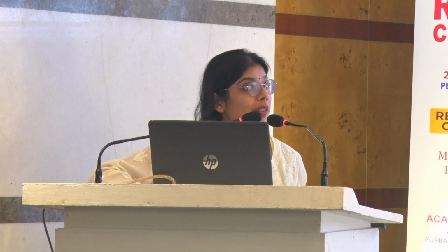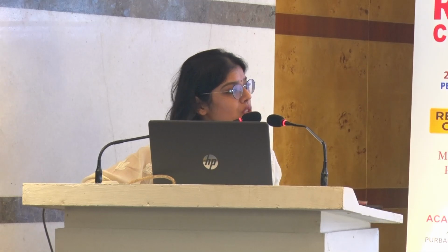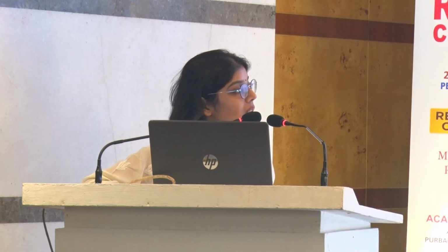So a few cases of heel pain. Heel pain can be because of multiple causes. This is a small retrocalcaneal bursa in the long axis and the short axis. If it's too symptomatic, we can always inject it from the lateral aspect of the heel.